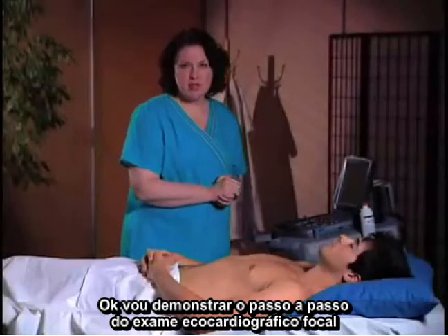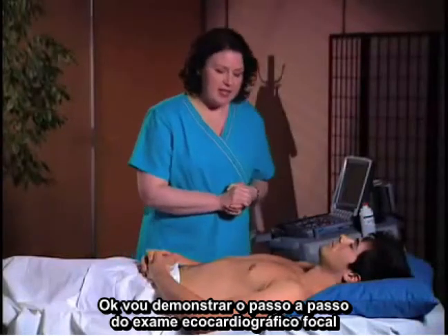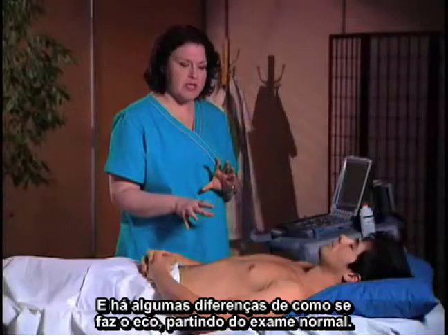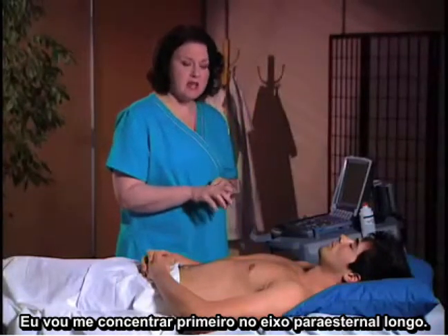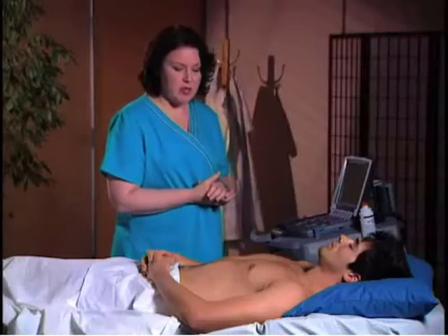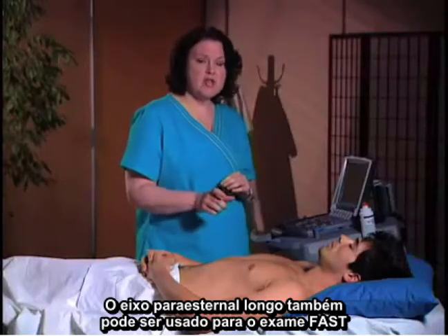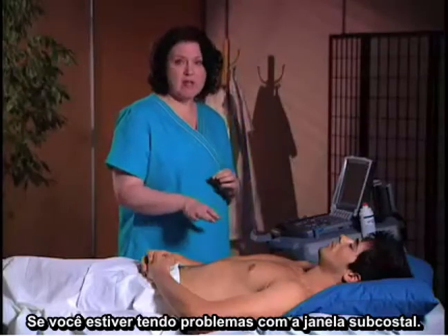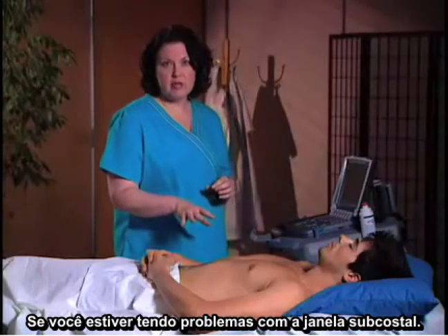I'm going to walk you through the steps of doing a focused echo exam. There are a couple of different views that you do as part of the focused echo exam. I'm going to concentrate first on the parasternal long axis, and then we'll walk you through the apical four-chamber view as well. The parasternal long axis can also be used as part of your FAST examination if you're having trouble doing the subcostal or subxiphoid view.